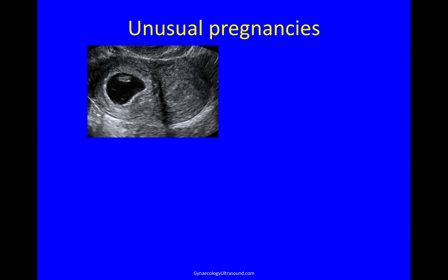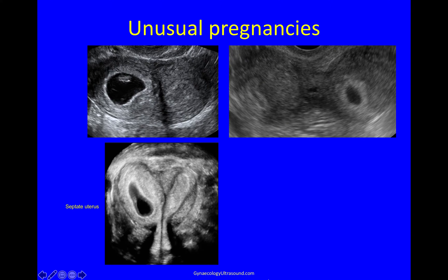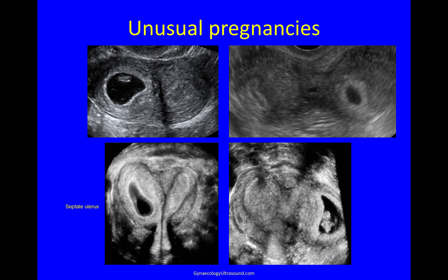Sometimes pregnancies are unusual. In this case there is a pregnancy in one horn and an empty uterine cavity on the other side, and on 3D it was instantly obvious that this is a septate uterus with the pregnancy in one horn and an empty endometrial cavity on the other side. That is very different from this case where the pregnancy is on one side and a bit of endometrial cavity is empty — on 3D this is clearly a unicornuate uterus with a pregnancy in the rudimentary horn. It is very important to be able to tell these two apart.